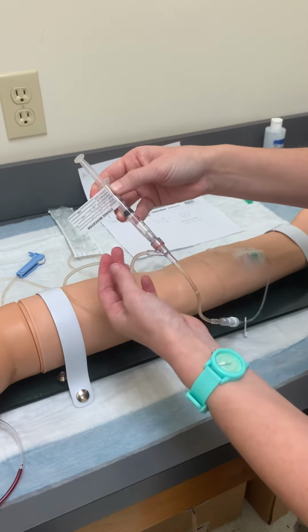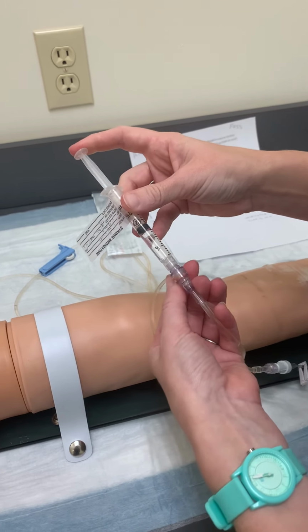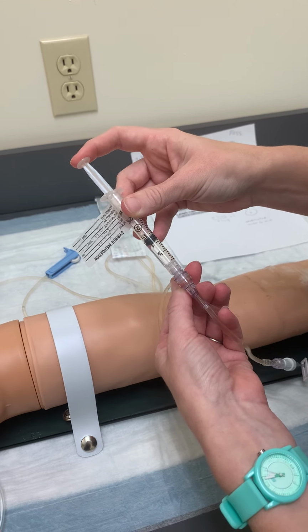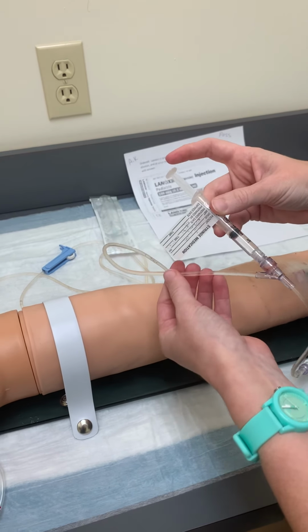Alright, and I'm back at 12. So I will clamp off behind, and I'll push another 0.4. 1, 2, 3, and 4. And I'll open it up and let it flush.